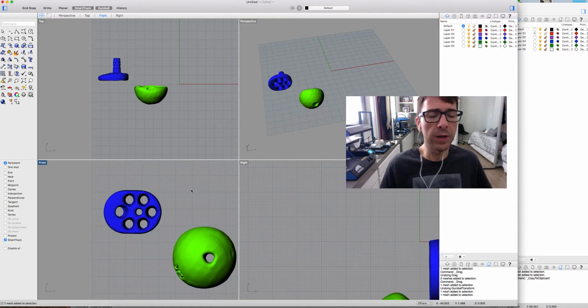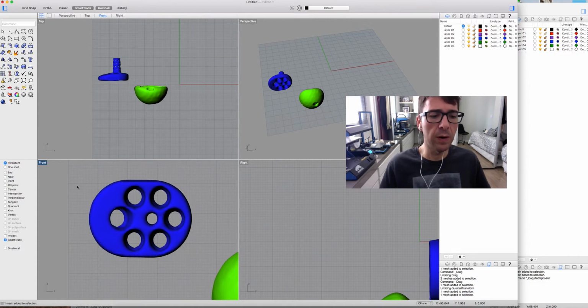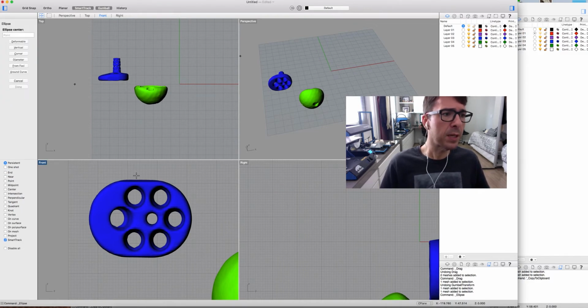We are going to start first on the base plate. As you can see, the base plate is oval. It's not that difficult to design an oval implant, but I'm going to show an easier way where we can create almost any shape. So we're going to click on this right point and click curve. We could do an oval or an ellipse, just like that. We could do an ellipse.